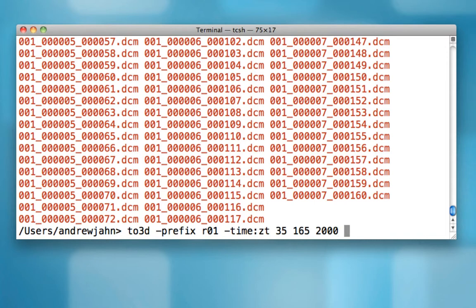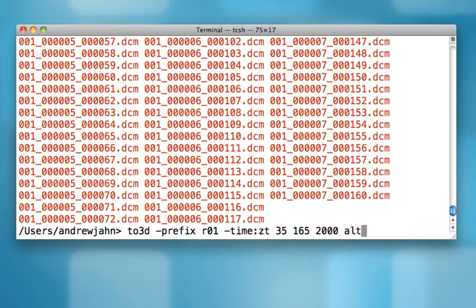And lastly, this time argument needs, how were these slices acquired? There are different methods of acquiring slices. One of the most popular is alternated or interleaved slices. So in other words, we have 35 slices in the Z direction. And the scanner will first acquire all of the odd slices. So 1, 3, 5, 7, 9, all the way up until 35. Then it goes back and acquires all of the even numbered slices. So 2, 4, 6, and so on. The syntax for this is alt for alternating plus Z. In other words, alternating in the Z direction.